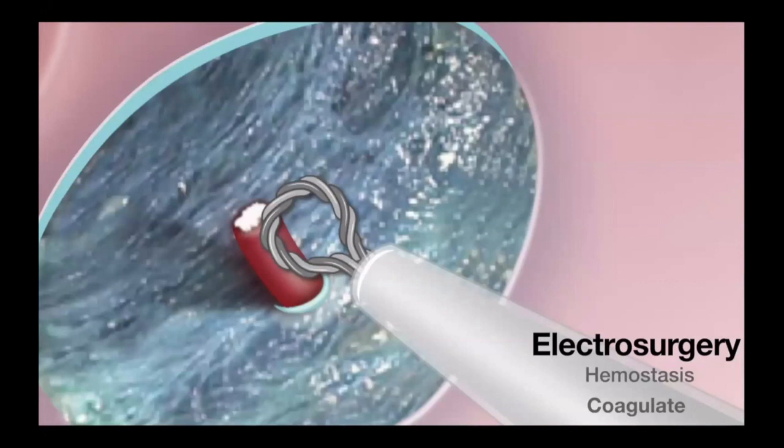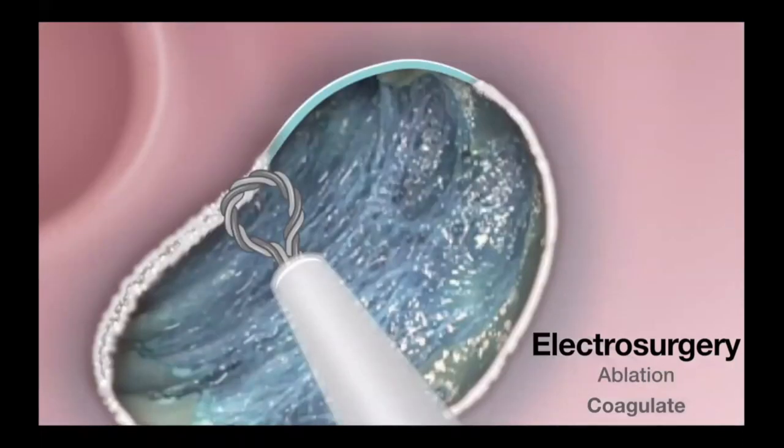You can share with your patient that if bleeding happens during resection, you can control it using coagulation current. Recently, we're able to do more with the snare — not only cut the polyp, but create hemostasis with the snare tip using soft coagulation. We can also ablate the edge of the polyp to cut down recurrence after endoscopic mucosal resection.